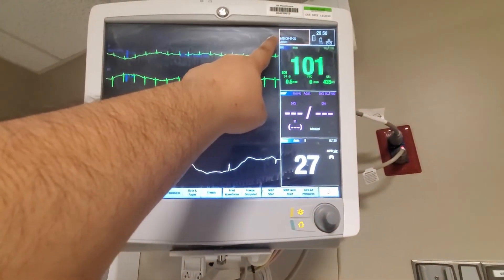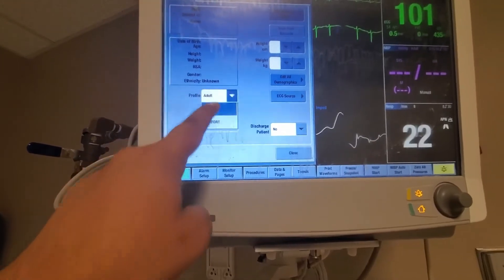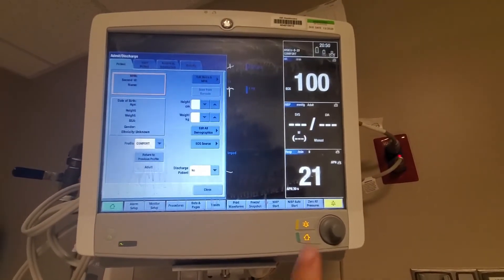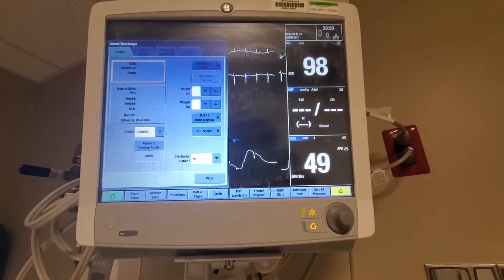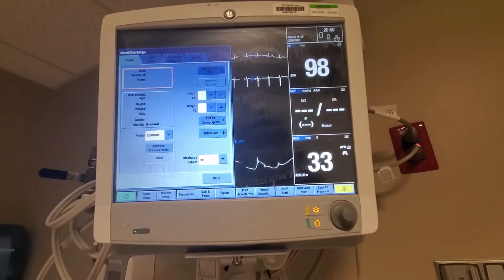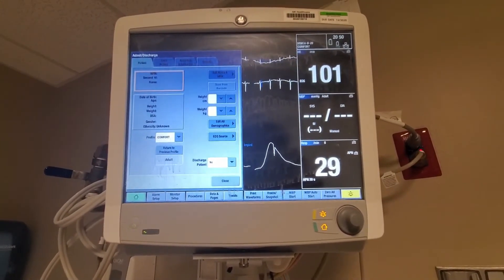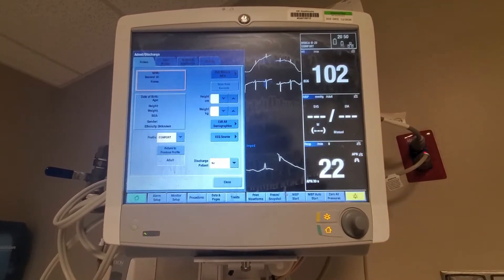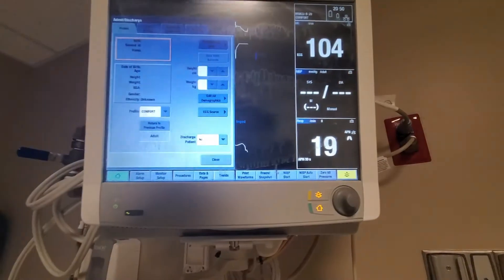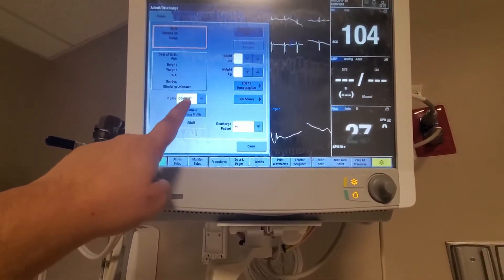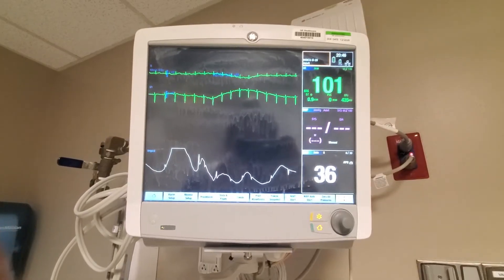We have to keep these monitors on because if we don't, they won't be reading off the patient. To activate comfort mode, go up to the top corner where it has the room number and patient's name, click that, go to profile, and switch from adult to comfort. When you do that, your screen turns completely white. If your patient is hypotensive or bradycardic it will not alarm in the room; if they're asystole it will alarm at the nurses station. To switch back, go to profile and select adult.